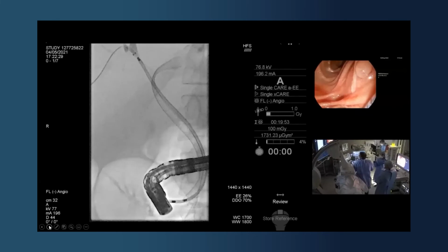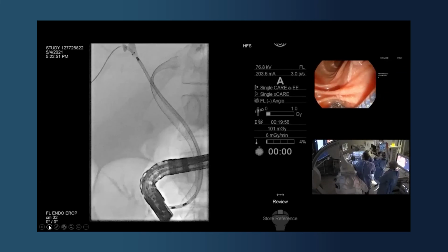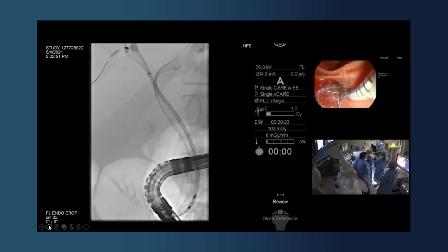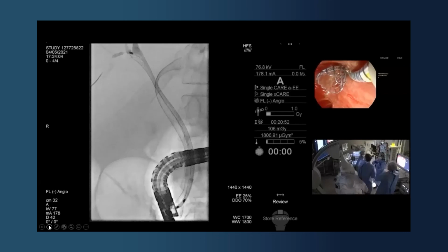I think we might have to deploy in this position, and hopefully it gets dragged forward a little bit. I don't think we're going to get it up any further than that. Screen, please. Let's start deploying. Okay, that was 90% perspiration, 10% inspiration. That okay? Yeah, all the way. Yeah.